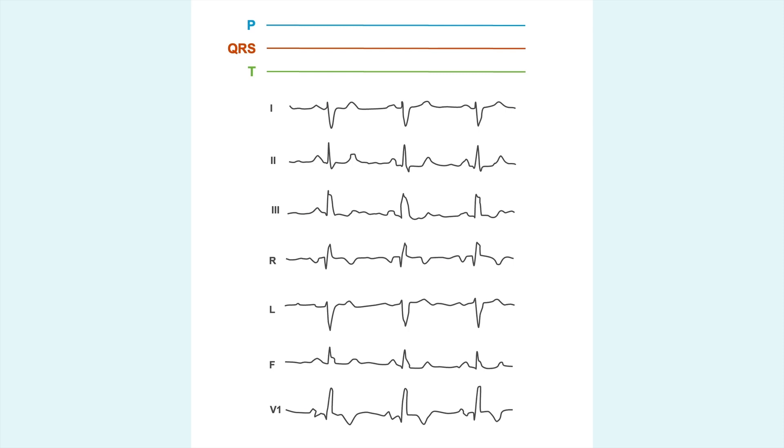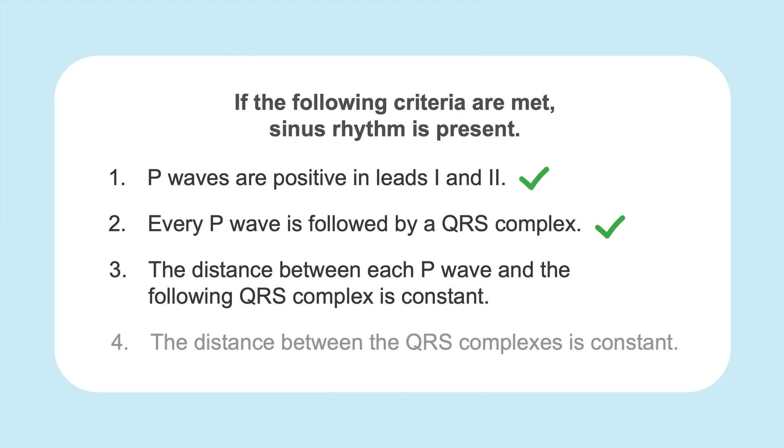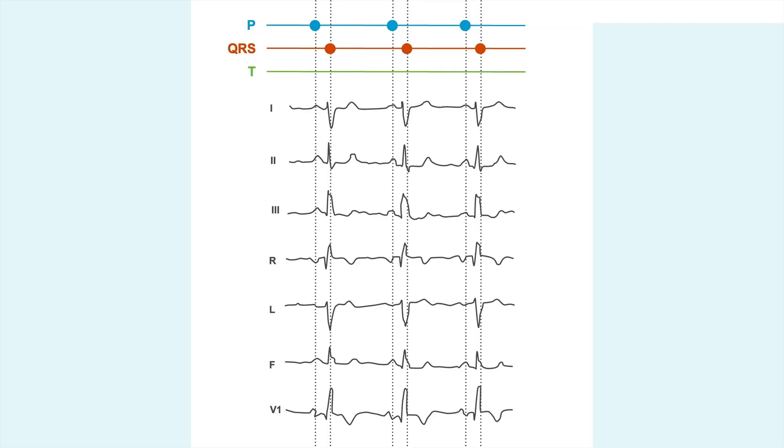Number two, every P wave is followed by a QRS complex. Let's look at our first beat. We have a P followed by a QRS, then again a P followed by a QRS, P QRS. Number three, the distance between each P wave and the following QRS complex is constant, which is true here. So this distance from here to here is the same as the distance from here to here and from here to here.